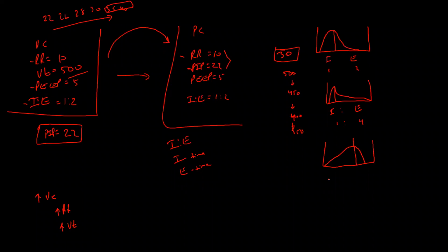So you're going to put the air in really slow, but because it's really stiff and wants to collapse, the air comes out fast. And so what happens is you can increase your respiratory rate, and you can go into inverse IE ratios, meaning you're taking a longer time for inspiratory than you're taking for expiratory.